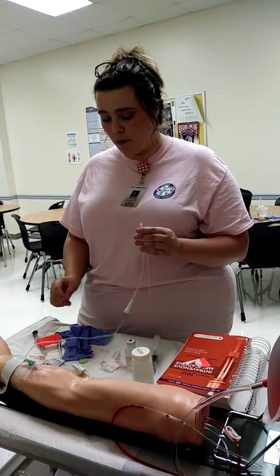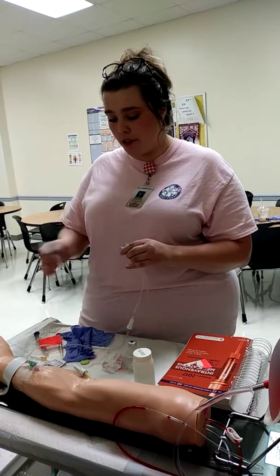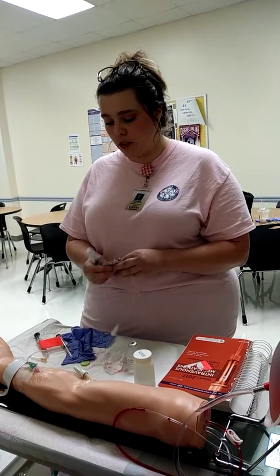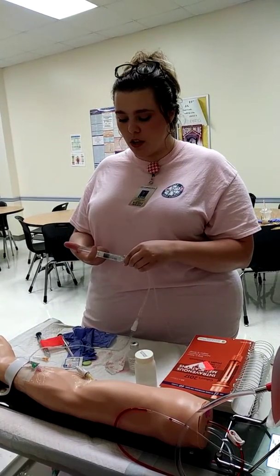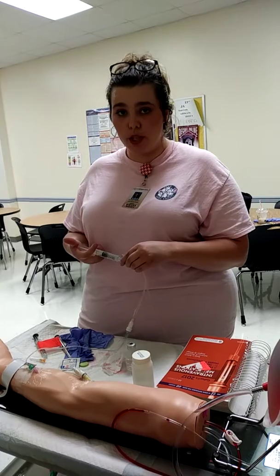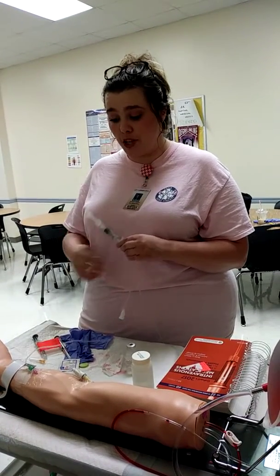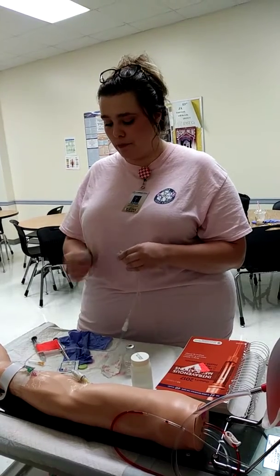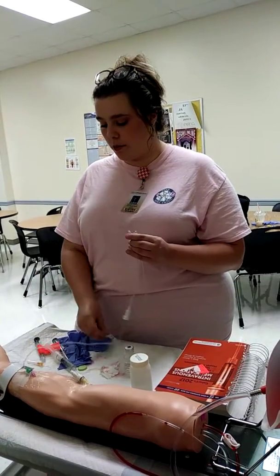All right. I'll get my flush, and I will make sure to follow the same method. Once it's all cleaned, I'm going to flush it over the same push-pause method. I'm going to stop and I'm going to flush. And I'm going to make sure everything is flushed out of that line. Now I'll go ahead at this point and clean it once again with another prep.